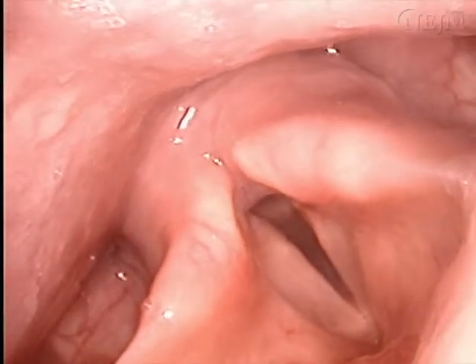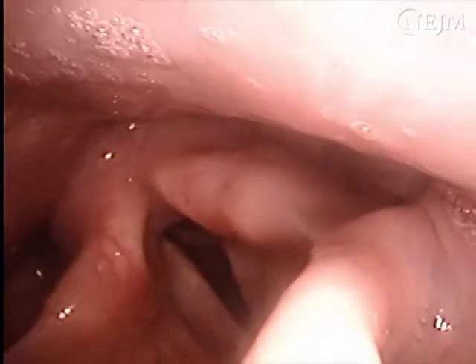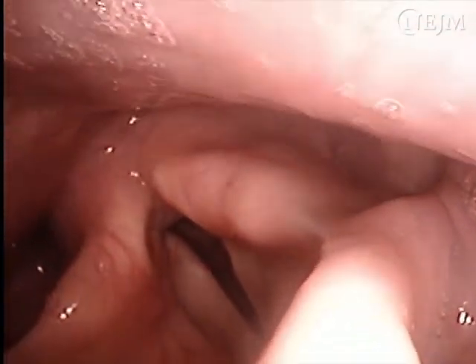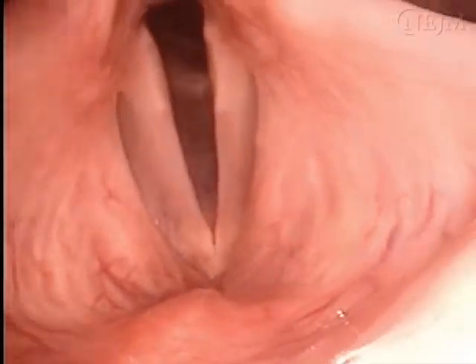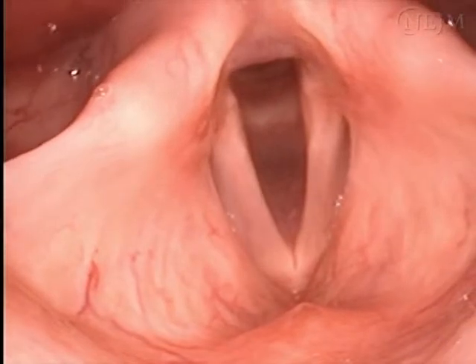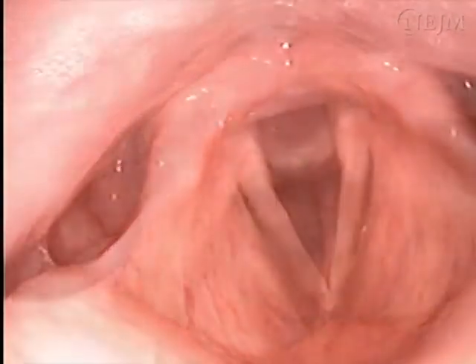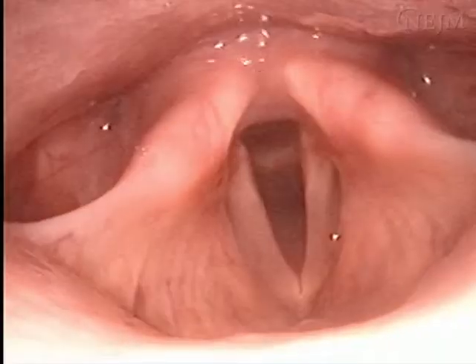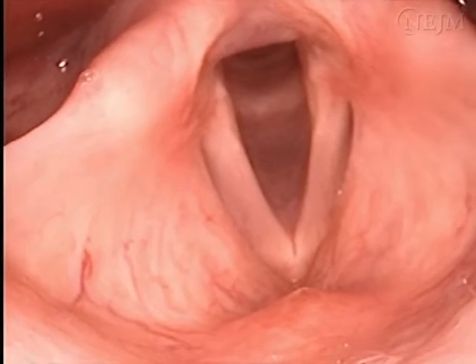The true vocal cord should appear clean, white, and taut. Note throughout any mucosal color or superficial irregularities. While the patient is breathing deeply, the glottis should remain widely open, with the vocal cords abducted. Usually some portion of the subglottic larynx can be seen. The anterior ring of the cricoid cartilage is often visible just below the true vocal cords. The laryngoscope should not be passed through the vocal cords, since contact can elicit laryngospasm.